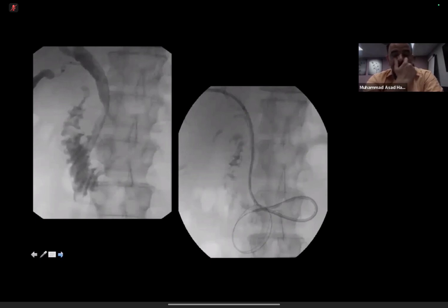Okay. You've rightly described the antibiotic prophylaxis, and you rightly described the other things. These patients normally then proceed to have some common bile duct stenting done as well, and then the catheter is taken out. Is there any procedure, or is there any step which you can take while performing this drainage procedure to aid in the diagnosis?